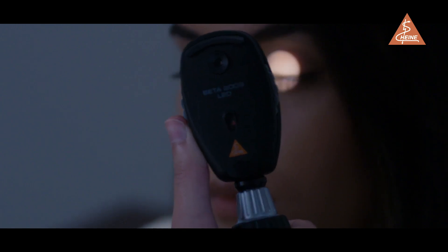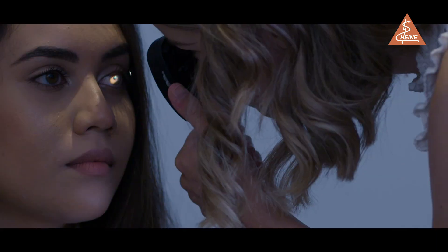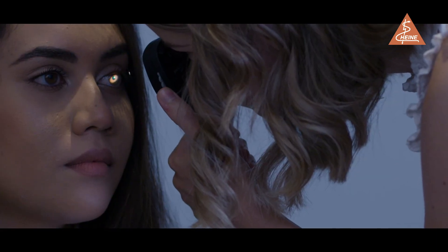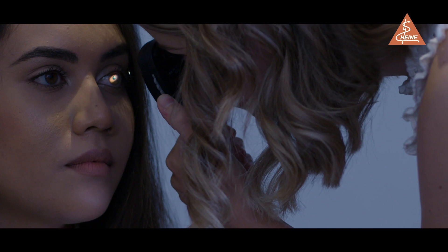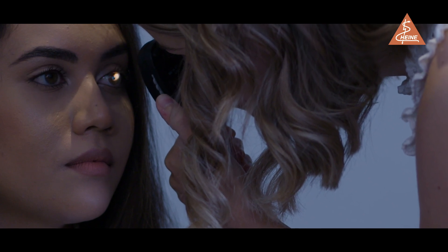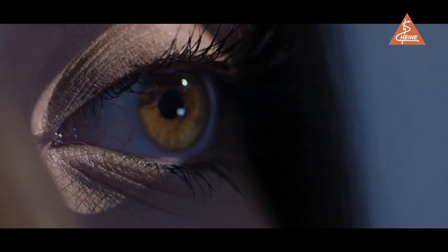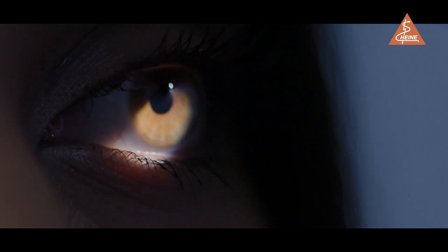Follow the red reflex as you get closer to the patient. Once you have established an image — usually a vessel near the disc — toggle the lens wheel using your thumb to improve image clarity. Once the vessel is brought into focus, follow it as it converges on the optic disc.